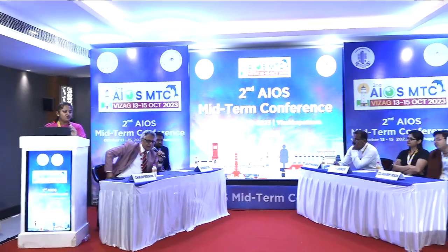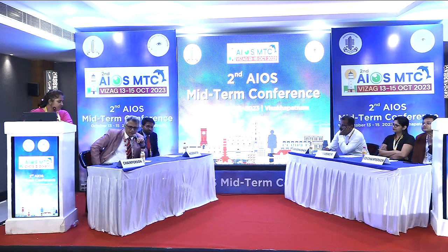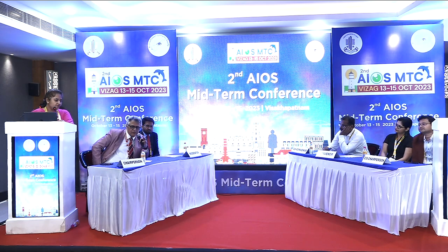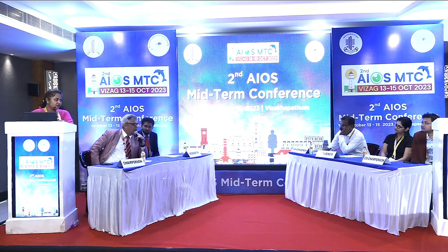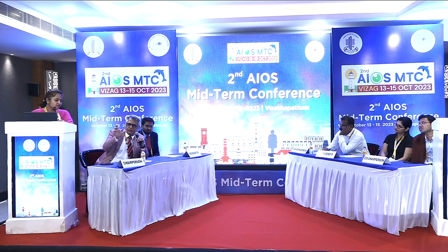Very nice documentation again. Thank you, sir. Fungal focal endophthalmitis actually is well documented after any gastrointestinal surgery. Yes, I also have multiple patients like this. The only difference is that, personally speaking, the clinical picture to me does not look like Candida. Candida lesions are slightly whitish in color and slightly smaller compared to a big granuloma. This is a yellowish looking lesion.